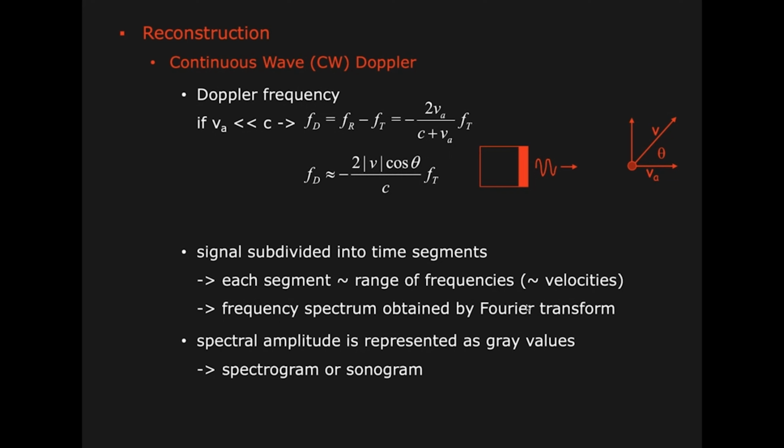But that means that we need a very long pulse in the spatial domain. But a very long pulse means that we cannot look at reflections anymore to see where they come from. Because to have a high spatial resolution, we said we need short pulses. The shorter the pulse, the better we can discriminate reflections from different objects, the better our spatial resolution.